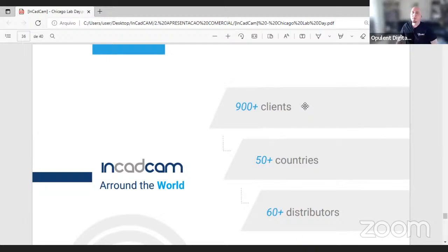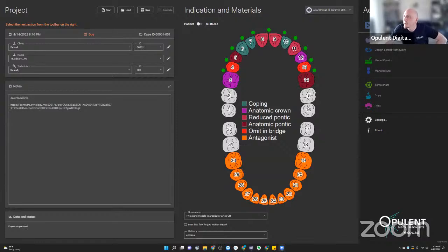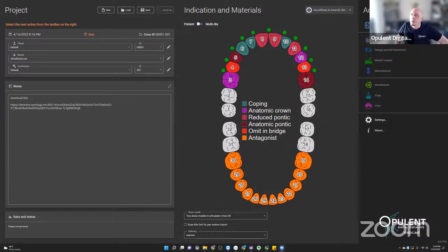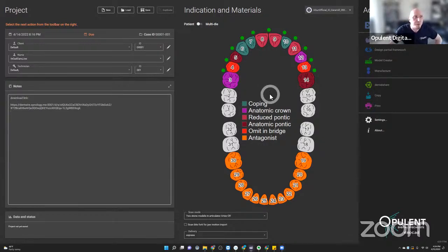Richard takes over as host and shares his screen. There is a link in the chat window on the Zoom call. If you're watching on Facebook Live and want the dataset, shoot an email to richard@opulentcatcam.com and I'll send you the link. You can download the folder and then in ExoCAD say Load, ExoCAD Projects, browse to the downloaded folder, and it will only show you the dental project files — double-click to open and import into your database.